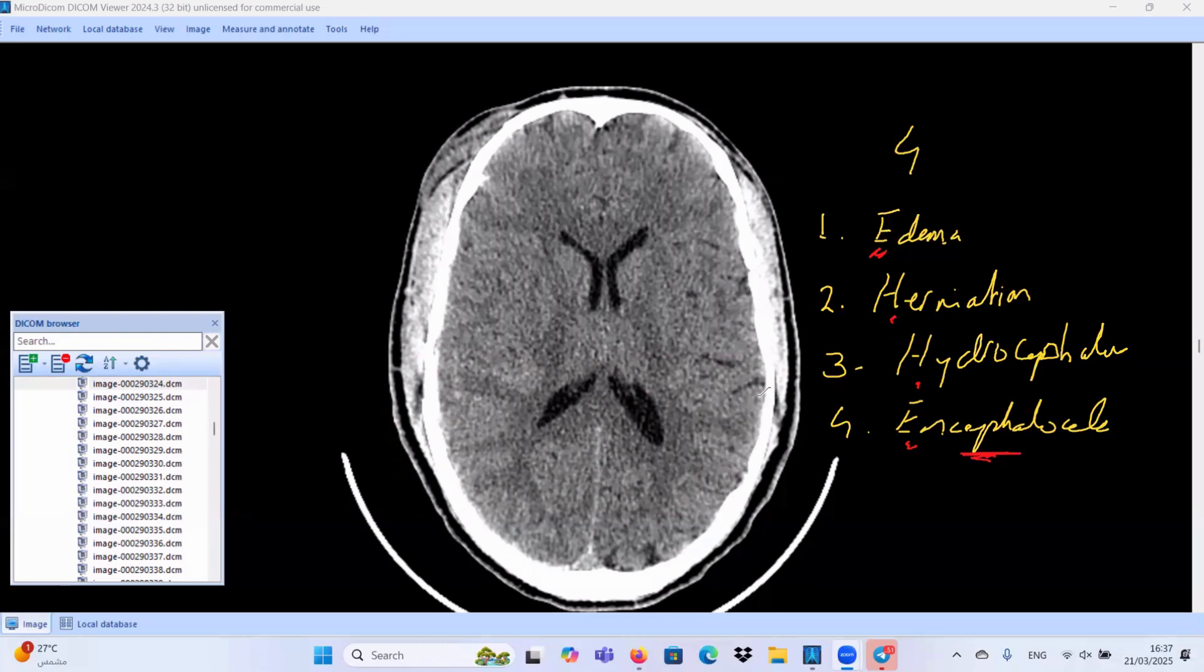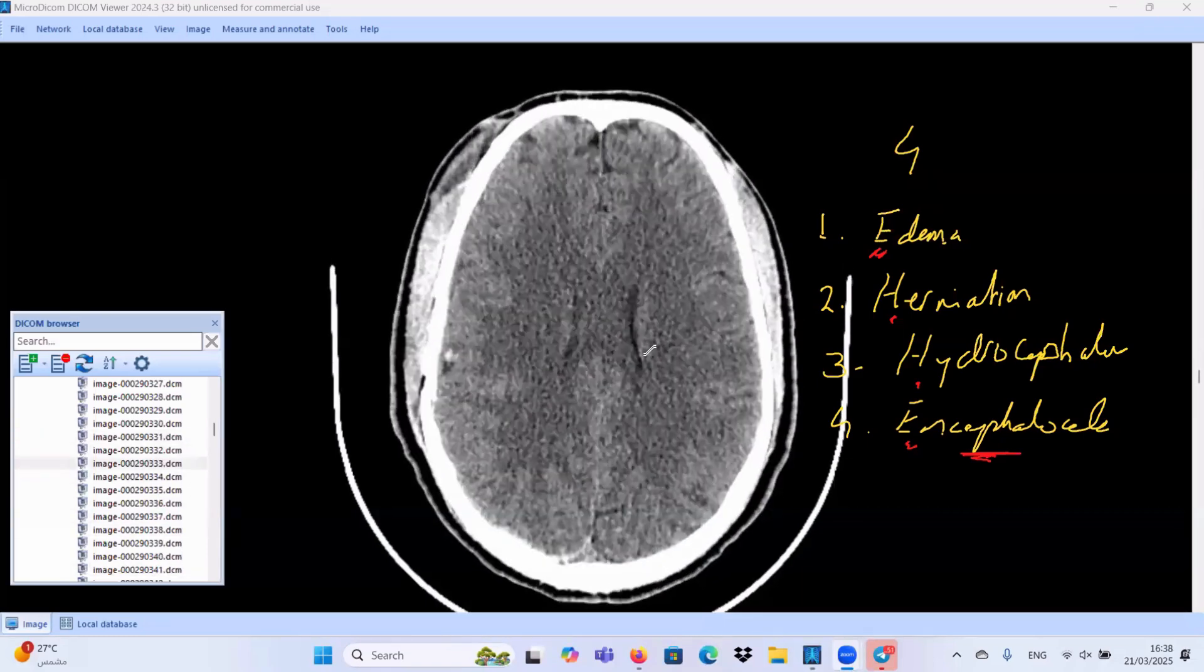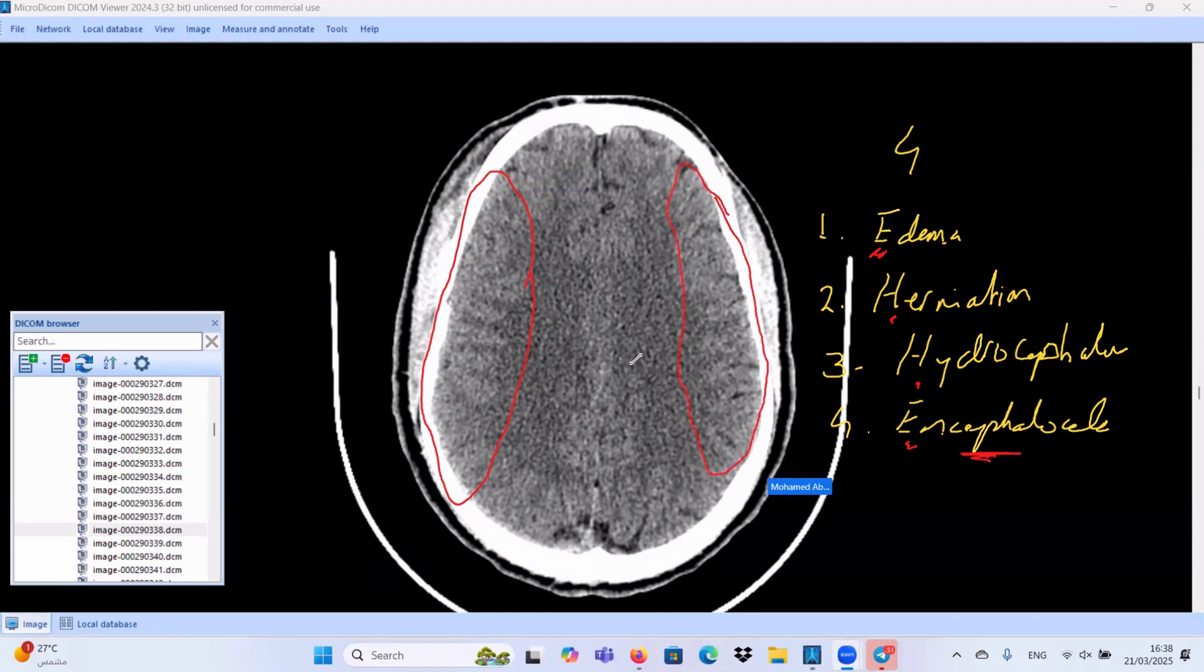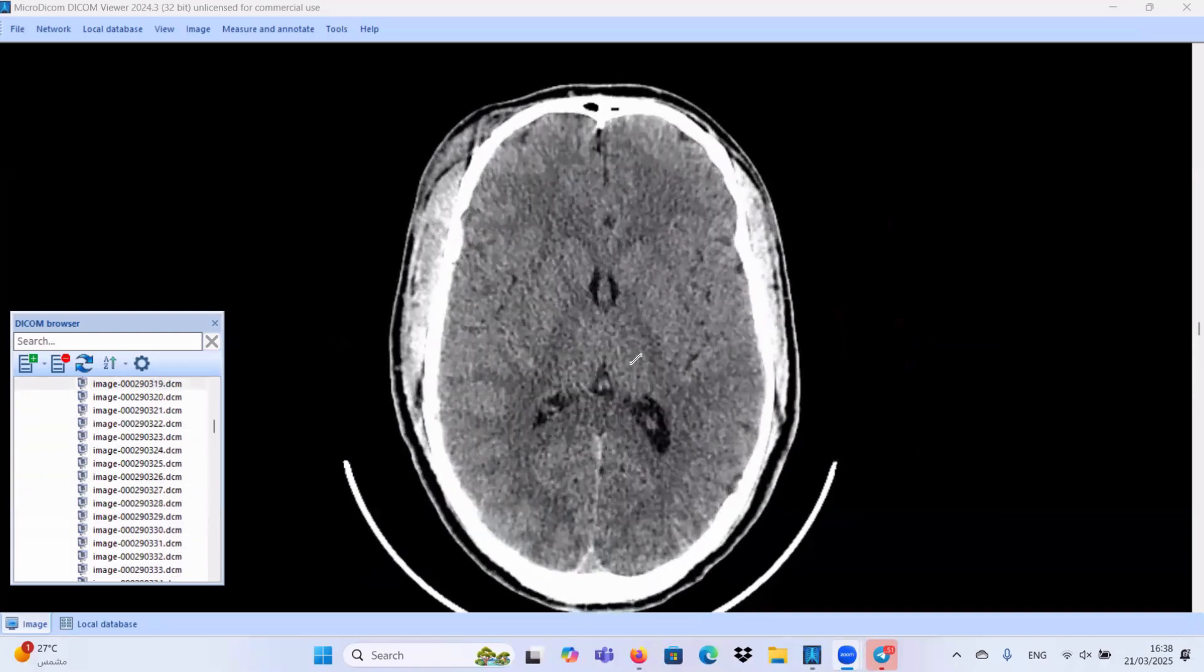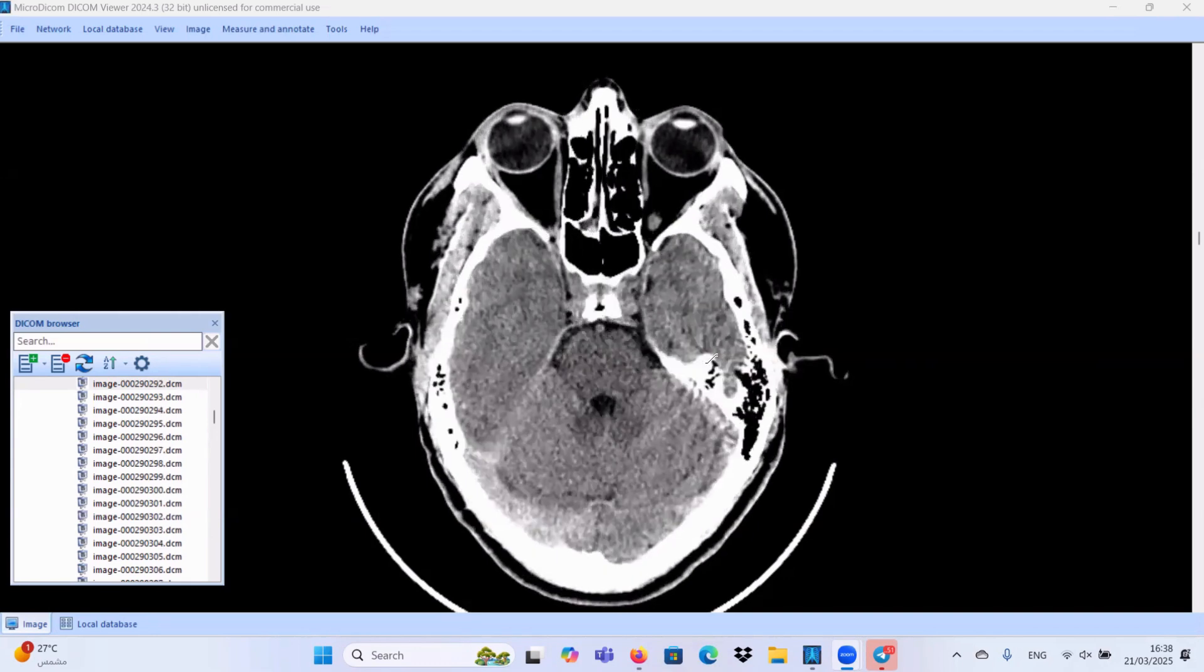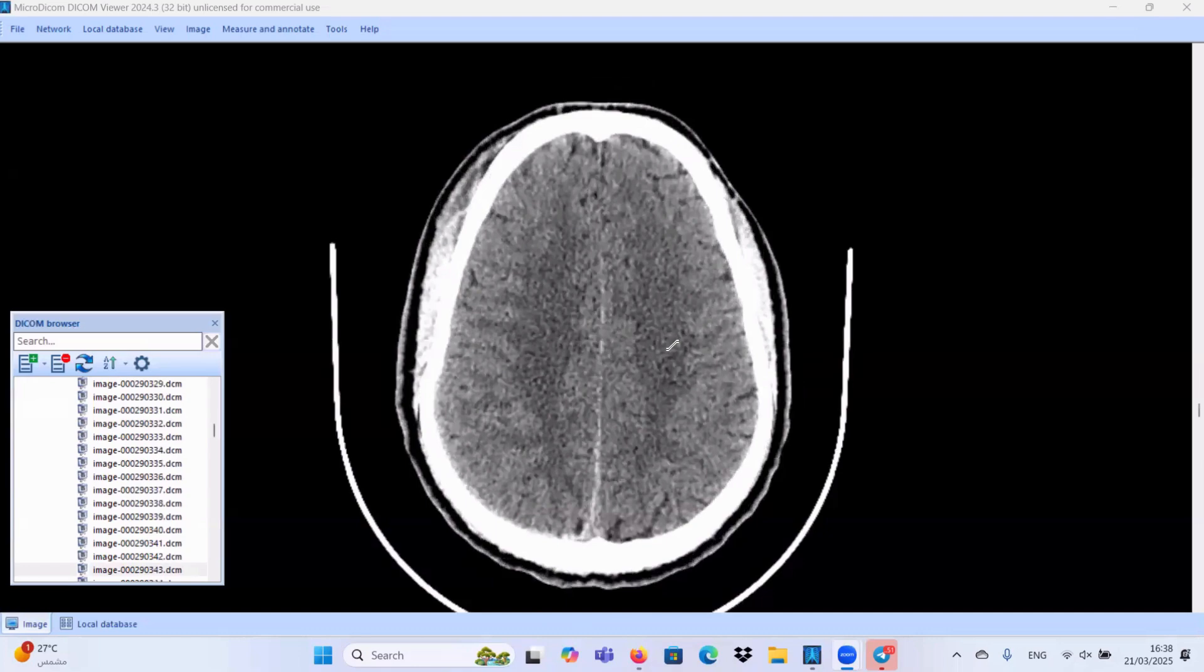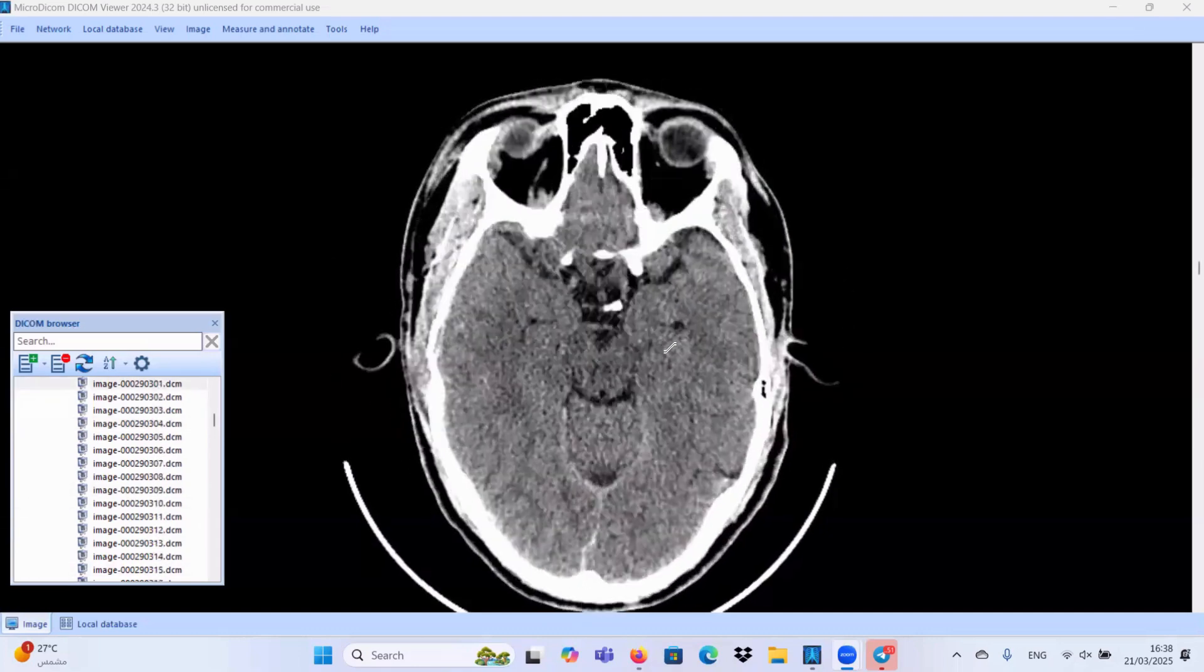I think we have mild brain edema. If we check the cortical sulci on the right side, it is swollen as compared to the contralateral side. So, we have evidence of mild brain edema. We don't have any evidence of brain herniation. The basal cisterns are clear. We don't have any evidence of uncal herniation or even subfalcine brain herniation. We don't have any evidence of hydrocephalus.